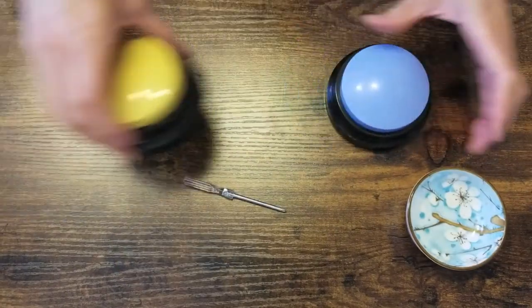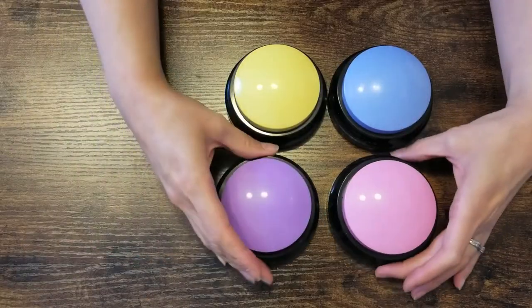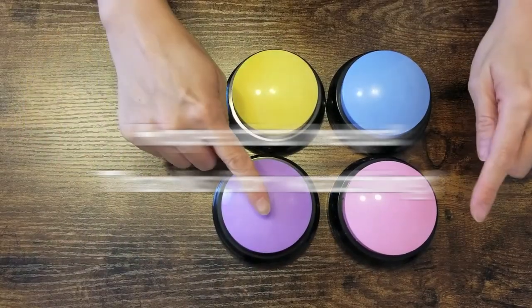All right, there we have it — four push buttons, all very easy to push.